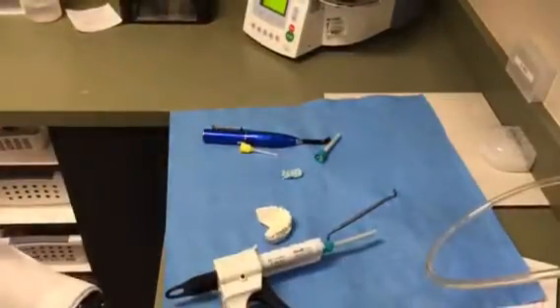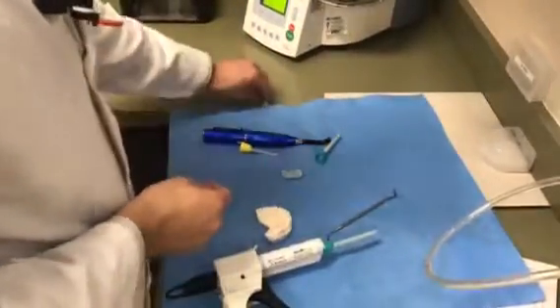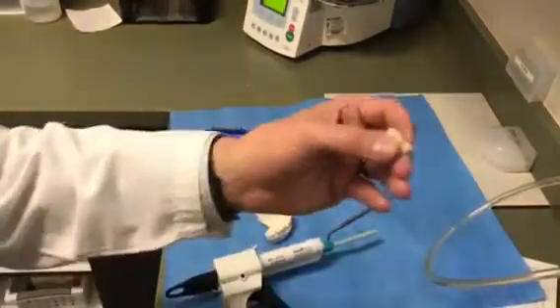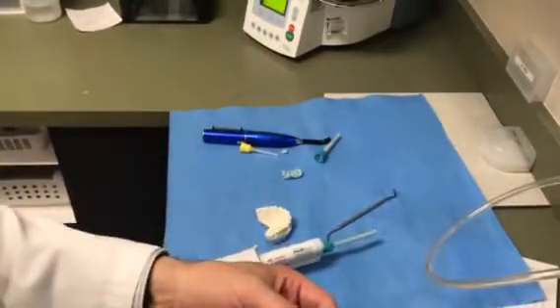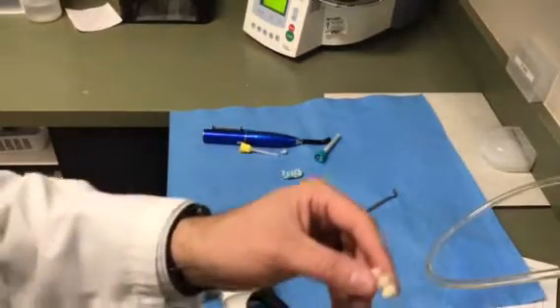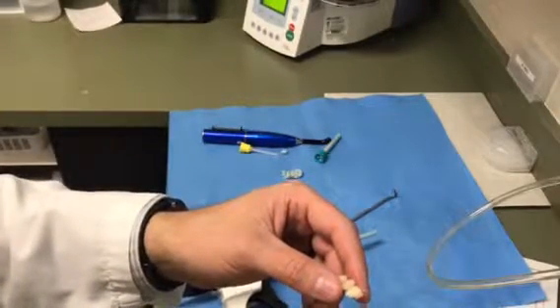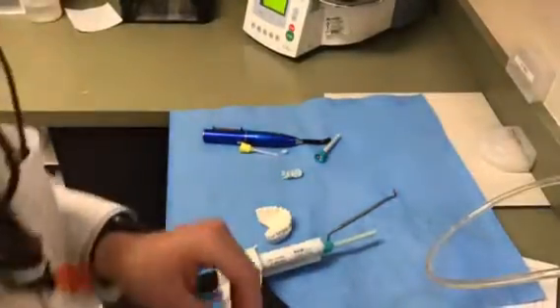Another method, and your quickest method, is just a photo and telling the lab to add about this much to this contact. There are a lot of times, especially when I'm in a hurry, that's all I do. I'll put it in the patient's mouth, and if I can get a good photo of it, I'll get a photo showing them the gap and tell them to add that much. And usually you're instructing them to add extra, so that you'd rather go ahead and take some off on that second visit rather than having a third visit.